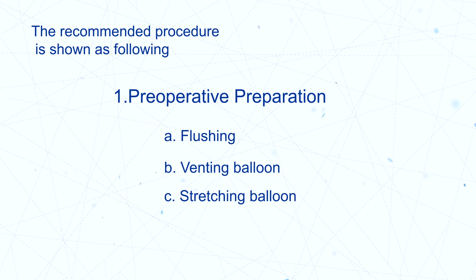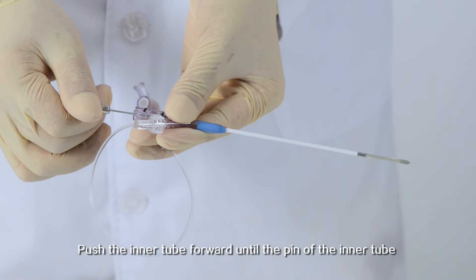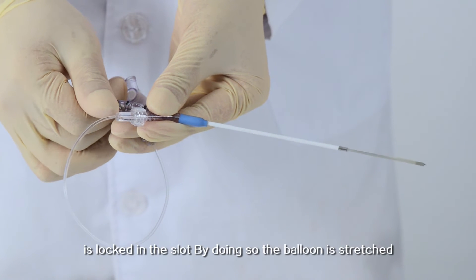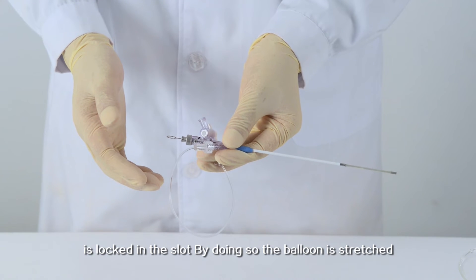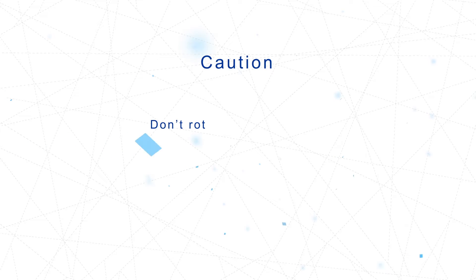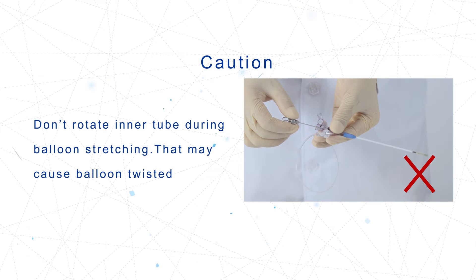Stretching the balloon: Push the inner tube forward until the pin of the inner tube is locked in the slot. By doing so, the balloon is stretched. CAUTION: Do not rotate the inner tube during balloon stretching, as that may cause the balloon to become twisted.